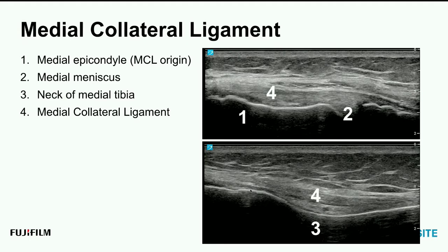Then it's going to drape distally here. Coincidentally, we do see a little bit of the enthesis of the deep component right here because this is a Sonosite PX image, very high image quality. And then superficially, after the deep component inserts, the superficial component still keeps going. Here's that medial neck of the tibia. We're going to keep going, keep going, keep going way out of the frame here. It goes into a very loose, leafy, very broad insertion across the tibia, almost to the tibial tuberosity distally.